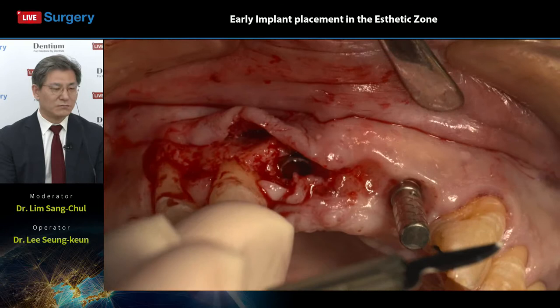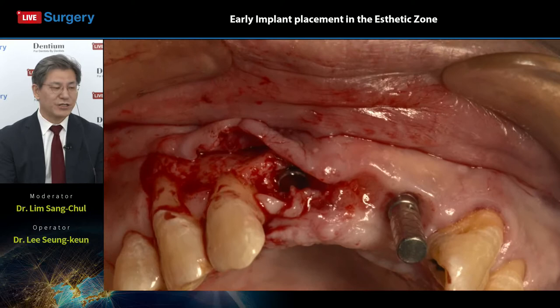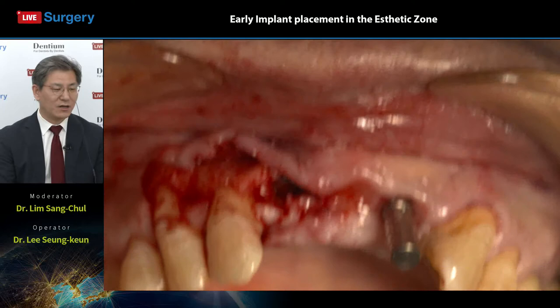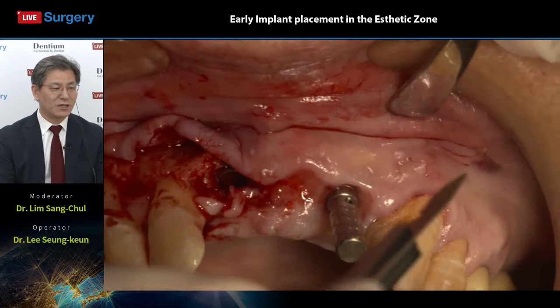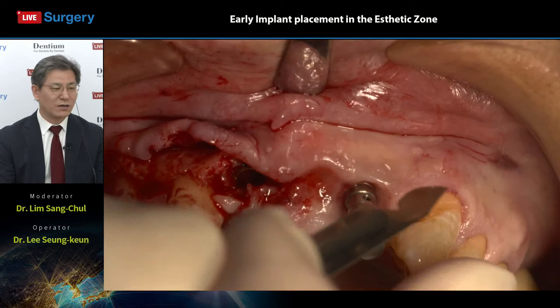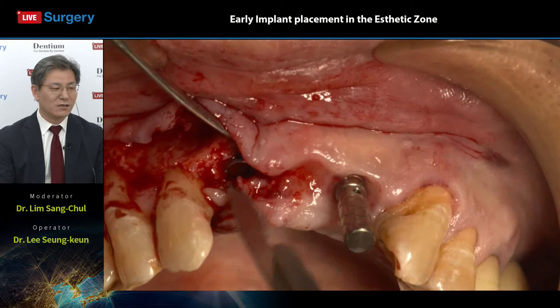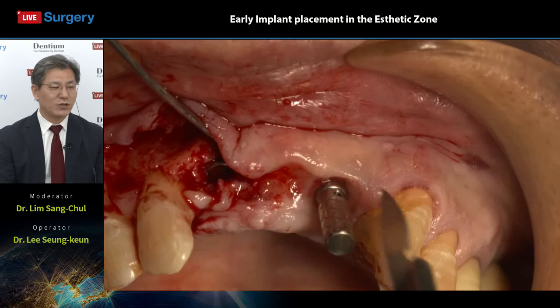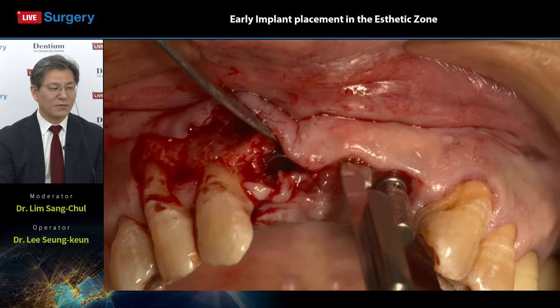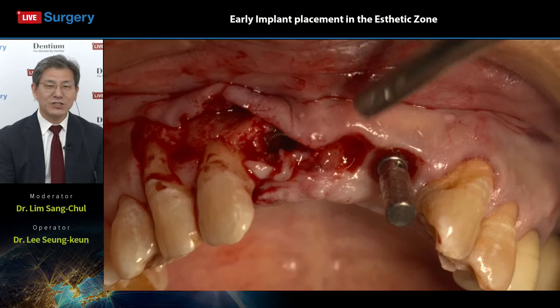Traditionally, the GBR technique. Okay, so he is changing the treatment plan. At first, tunneling was the planned procedure for the vertical augmentation using osteotomy. Now he already knows the treatment plan. So, flap extension. The horizontal incision line is extended until the number 21 implant, the already installed area. This big horizontal incision is necessary to perform the conventional type GBR procedure. So he is changing the treatment plan.